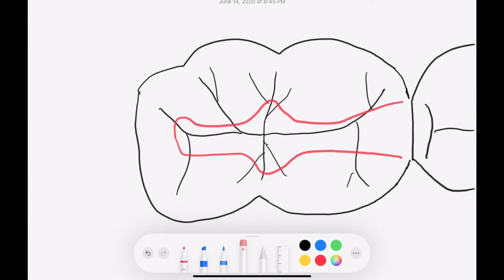However, when practicing on a patient, if the carious lesion does not extend to the buccal or lingual, you can keep those contacts intact. In this example, however, buccal and lingual allow passage of the explorer tip, and gingival contact is broken. You will always break gingival contact for convenience form.